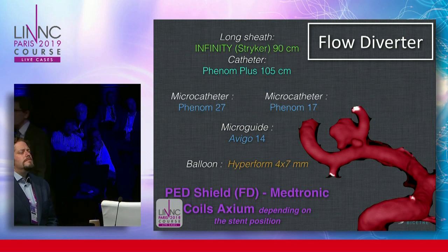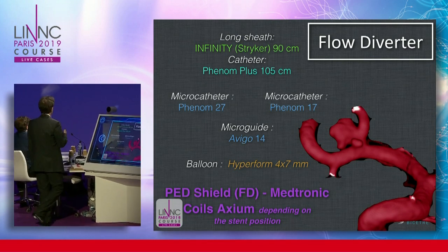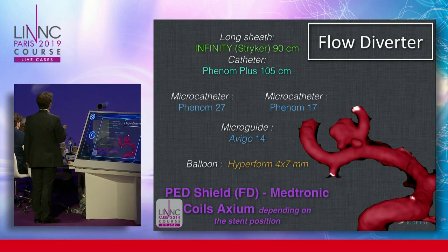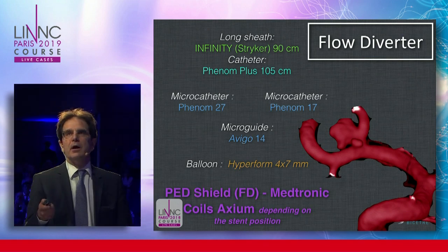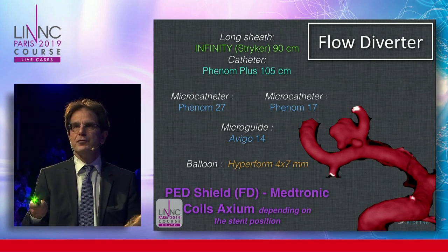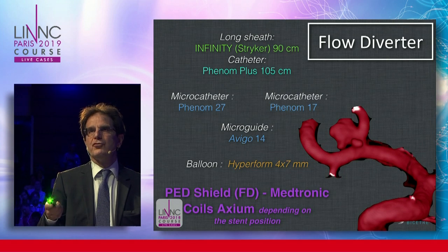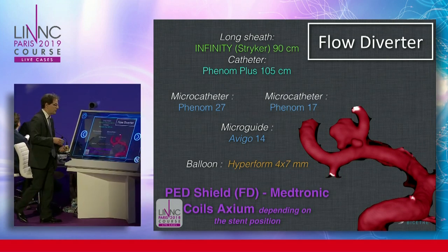So Jacques will explain the philosophy of that. And if they place the pipeline either in the upper branch or in the lower branch, if you deliver in the lower branch, then you will cover this one, and you have to be more or less sure that there is a potential supply to this branch.